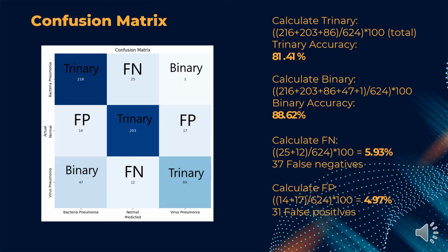We also want to minimize any false negatives because that is the worst case scenario for any patient to be sent home who has pneumonia but was diagnosed as healthy. We also have developed strictly binary AI as well to determine whether someone has pneumonia or is healthy.